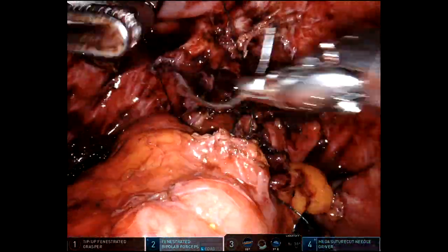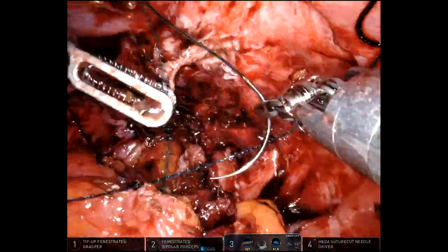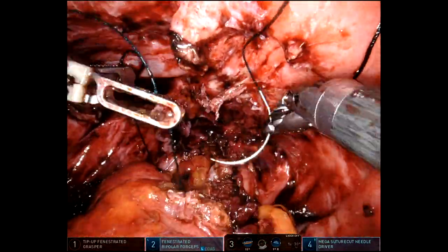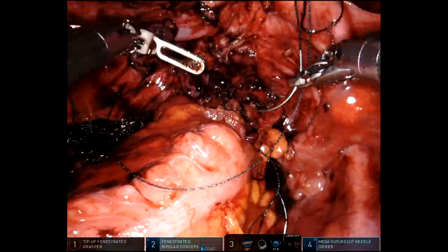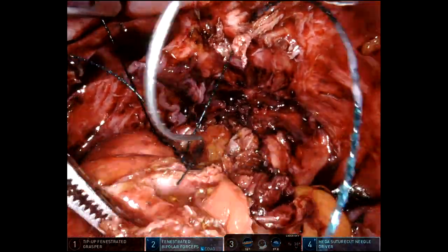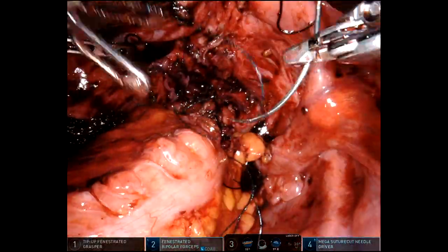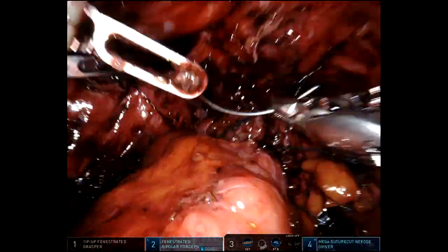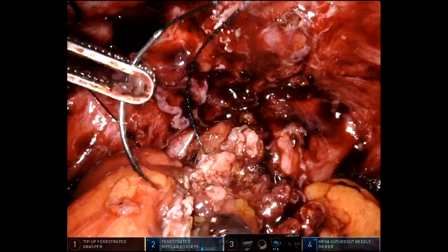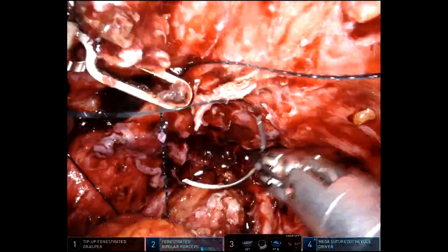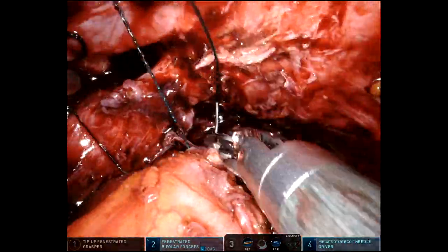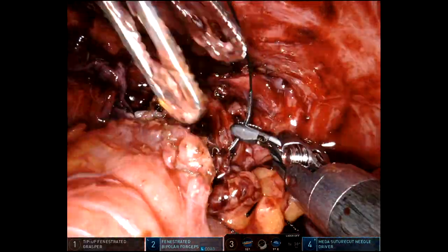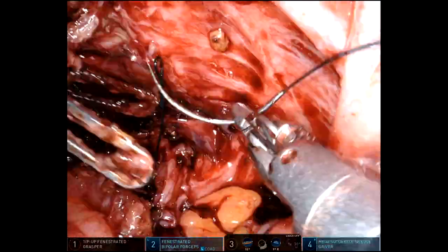Then I'll suture the inner back row with a 3-0 V-lock, starting in the middle and suturing out around the left-hand side. This is not the prettiest demonstration of this anastomosis as it's much deeper in the pelvis and the bowel edges look pretty ratty. I'm suturing out around the left side of the anastomosis, then turning the needle around so it's on the outside, starting in the middle and suturing towards the right side.